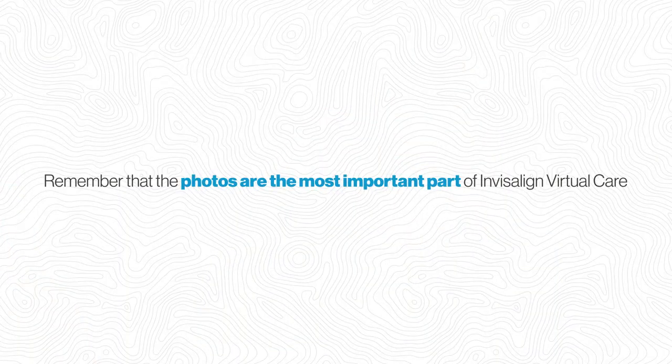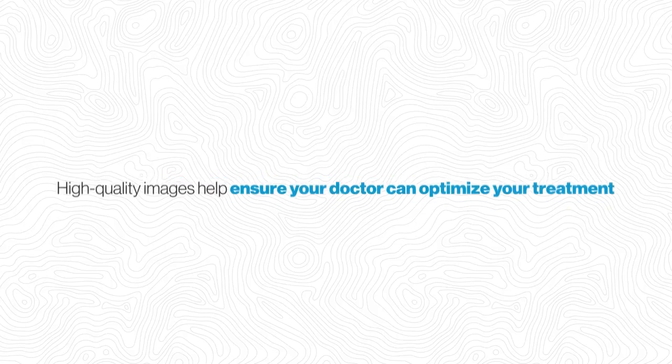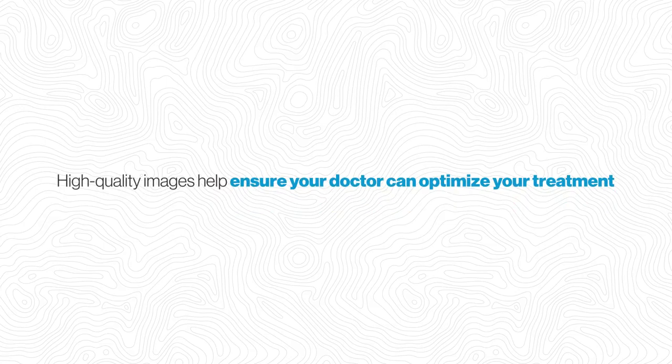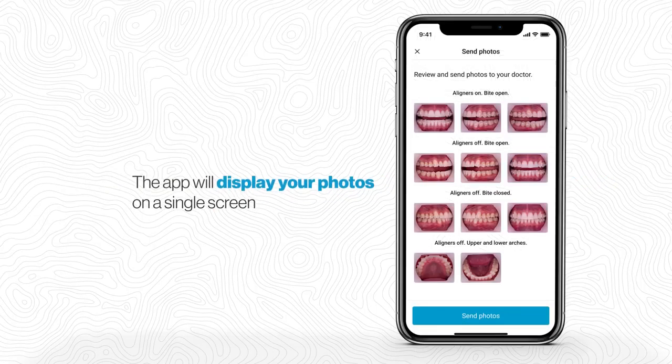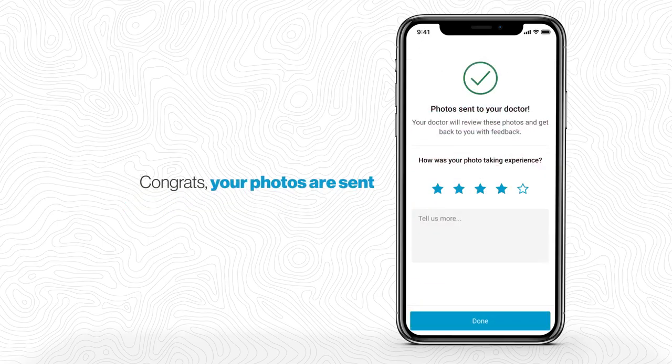Remember that the photos are the most important part of Invisalign Virtual Care, so make sure to follow the photo-taking instructions before submitting photos to your doctor. High-quality images help ensure your doctor can optimize your treatment and keep your treatment on track. After you finish taking your photos, the app will display your photos on a single screen. Before you submit, please make sure your photos are clear. Now tap Send Photos. Congrats, your photos are sent.